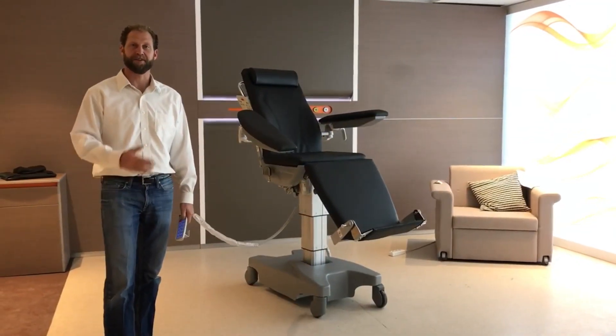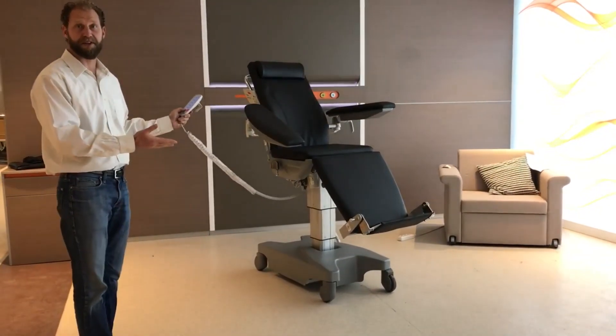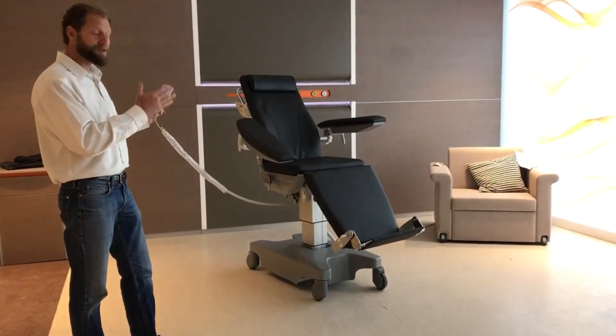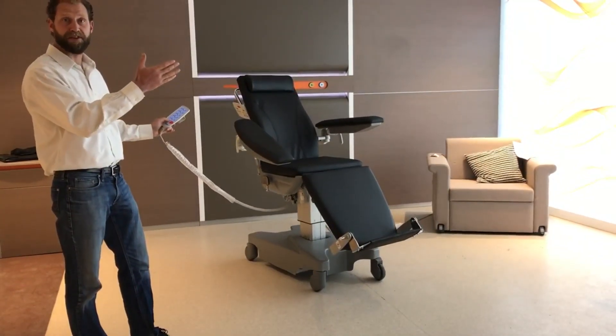Hello, this is Jonathan Powell with H&T Medical here to show you the 2017 6000 series dialysis chair. A couple key features: 700 pound weight capacity, UL certified, goes from 19 inch low entry height to 39.5 inches.